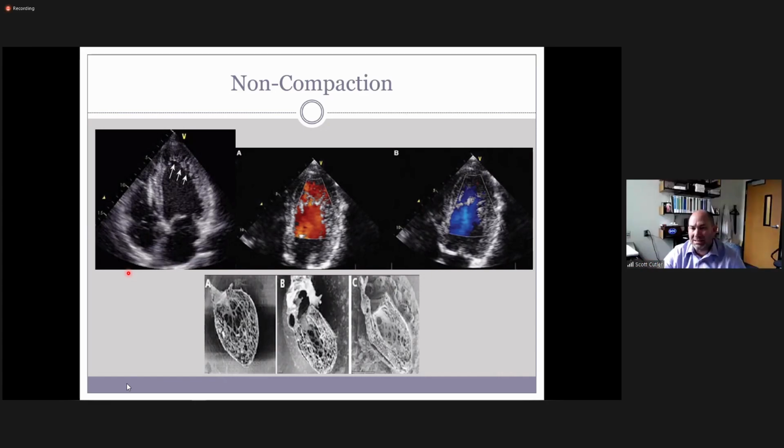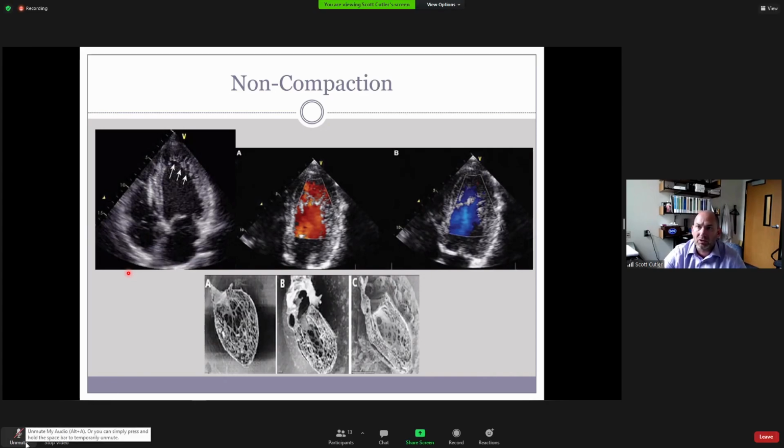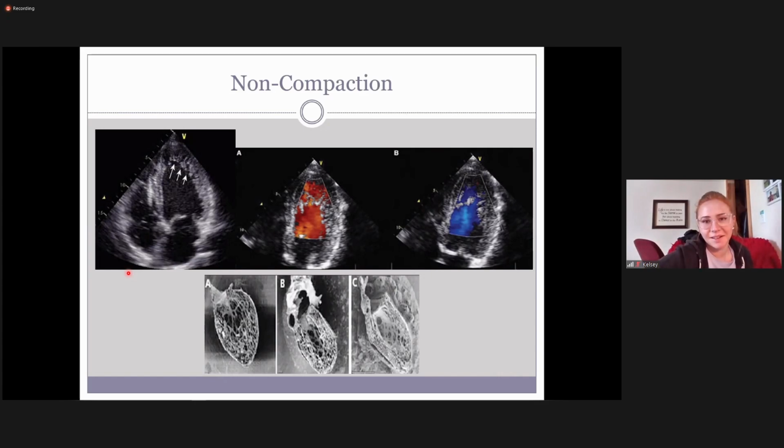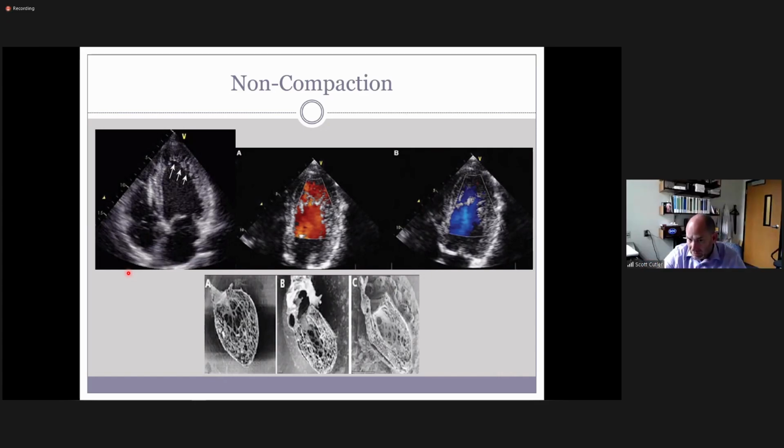So think back to basic physics though. What characteristics about your sound wave do you want to show detail, as much detail as possible? High frequency. High frequency, absolutely. So turn your color frequency to the highest possible frequency.